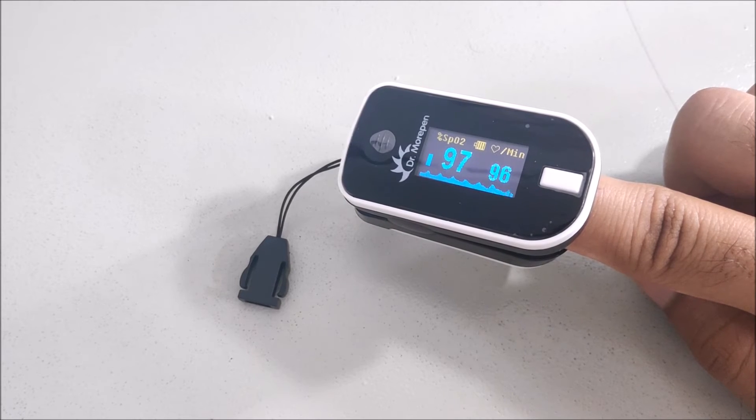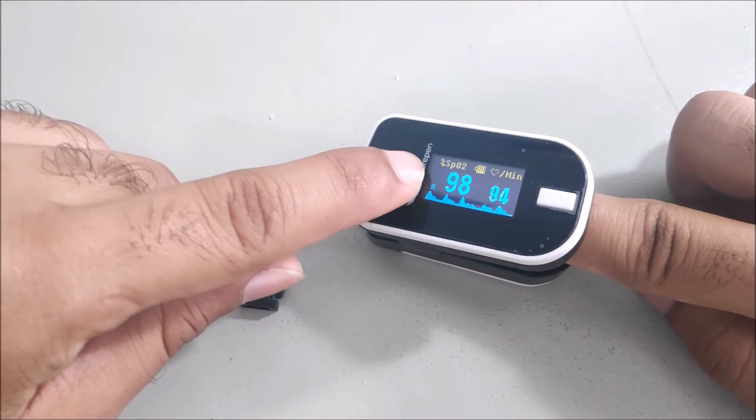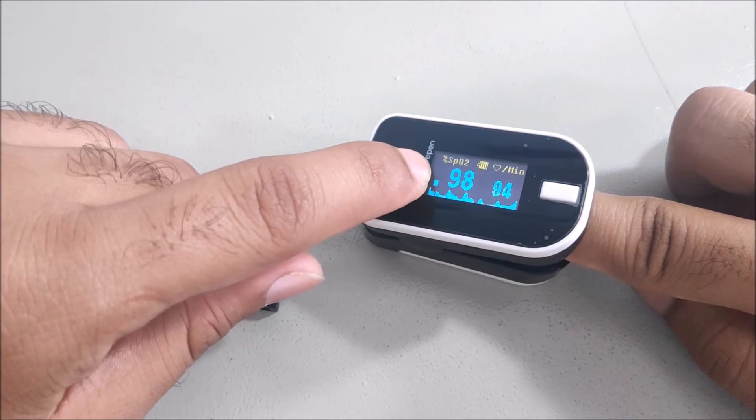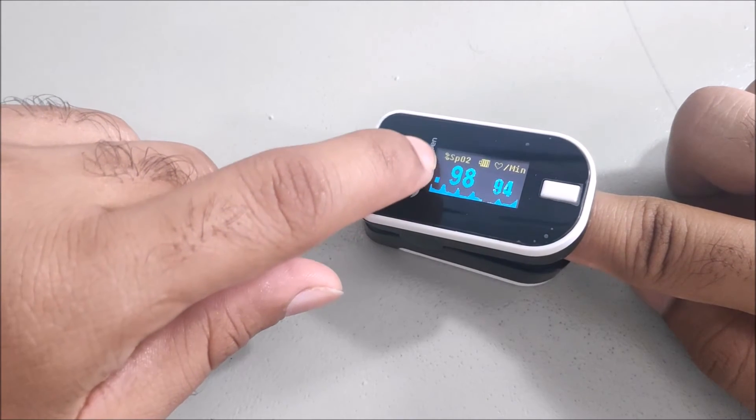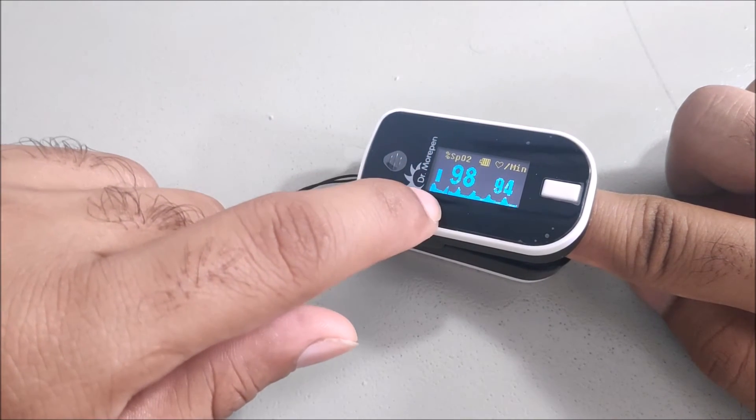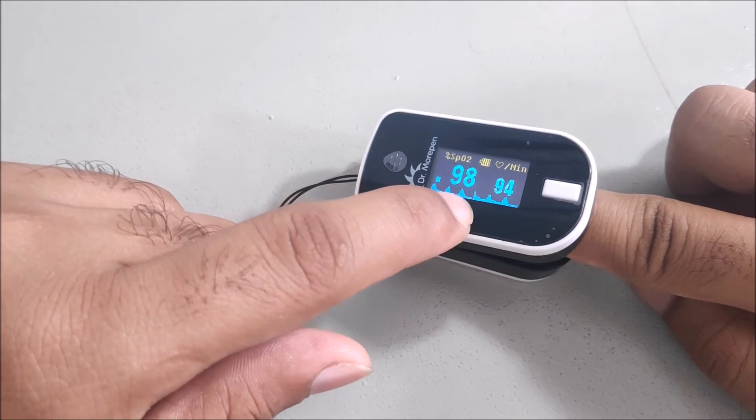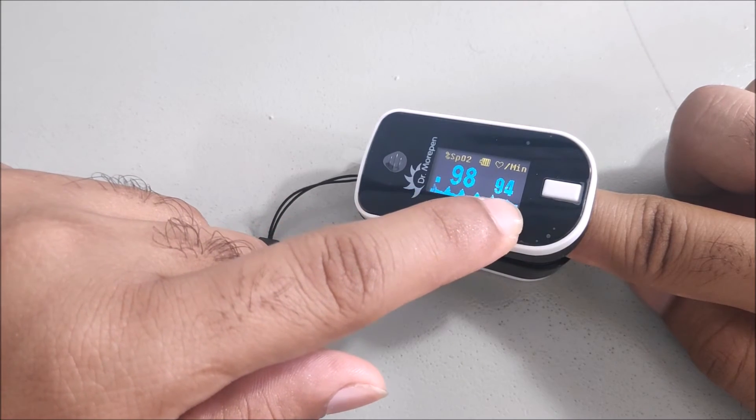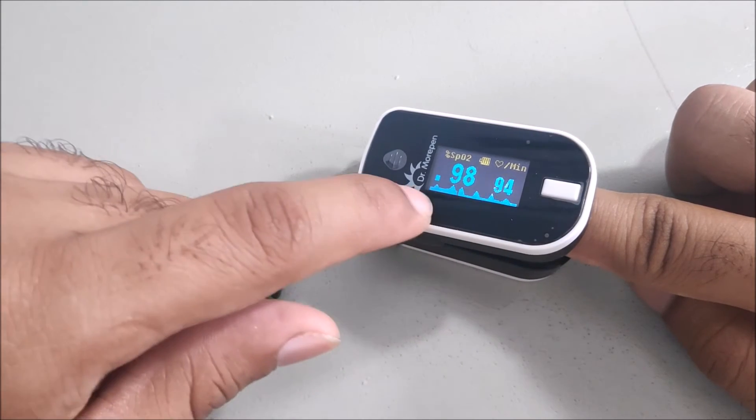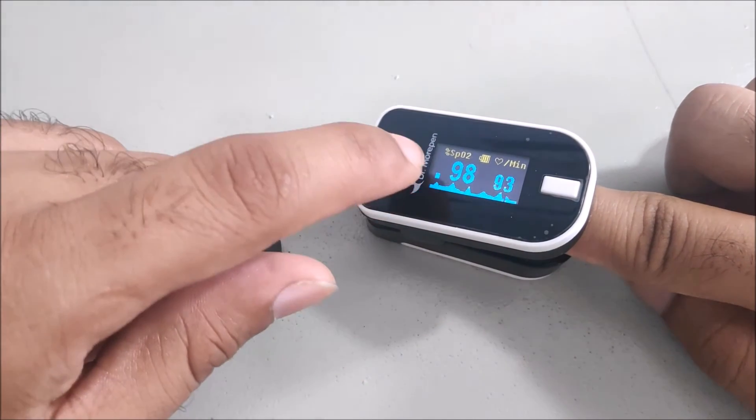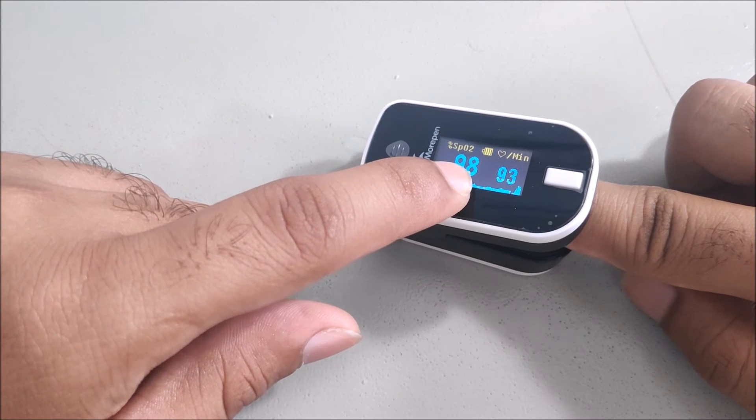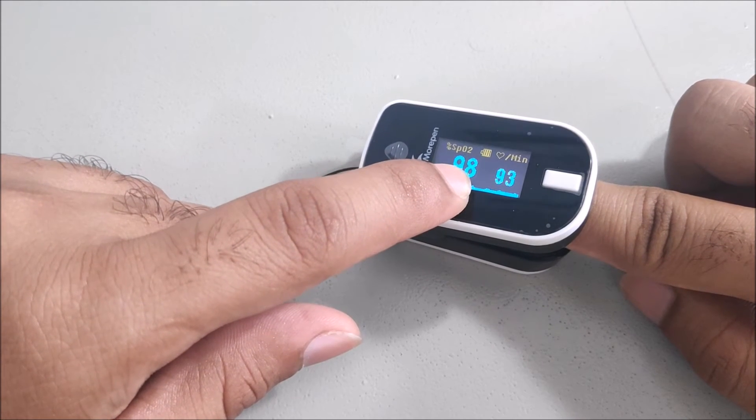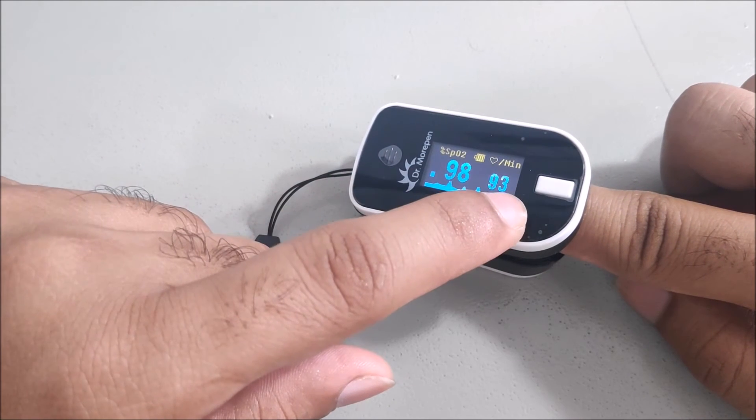Every heartbeat is represented by this graph. This bar is representing the heart activity, and this is the tracing of the heartbeat activity. So basically, this one is oxygen saturation or SpO2, and this is the heartbeat.